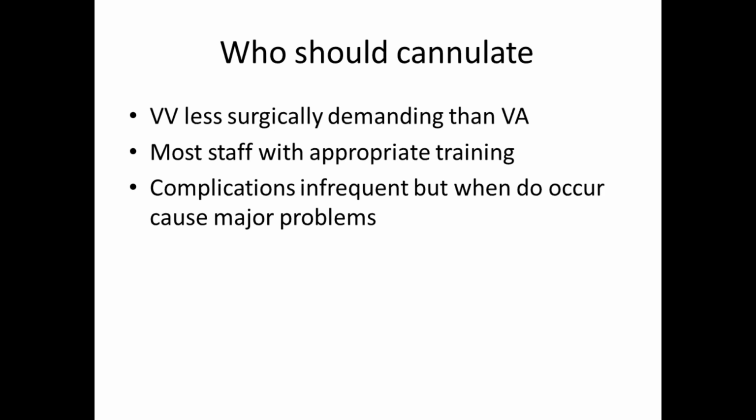Who should cannulate? That's a big question. This again depends on your centers, whether the unit is run by the surgical staff or by the intensivists. Usually intensivists prefer the Seldinger technique. Surgeons prefer that if it's open, because that becomes the easier task for them. So that depends on that.